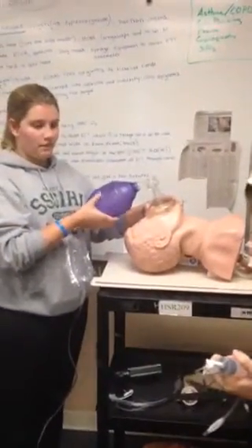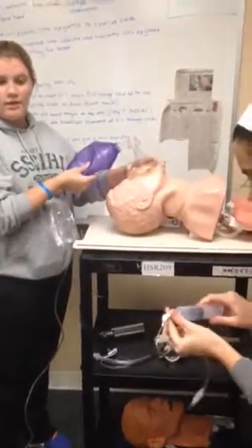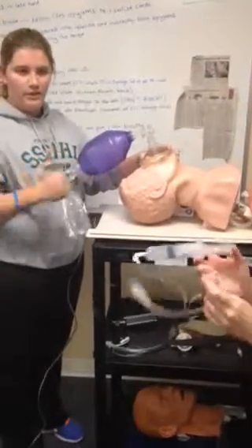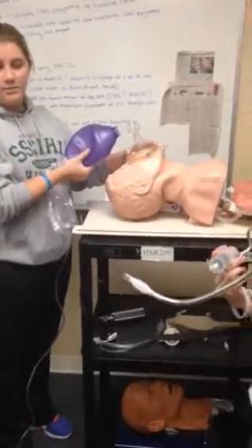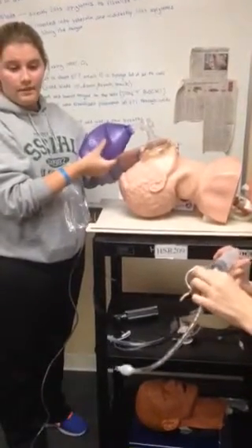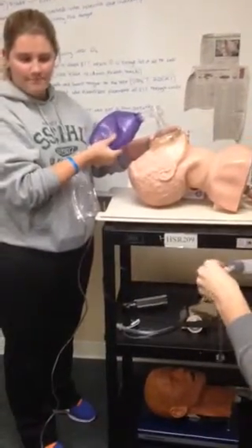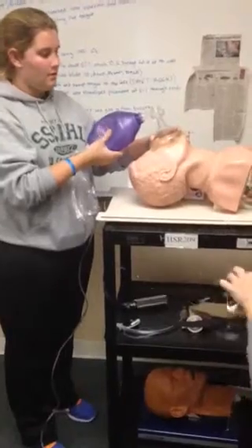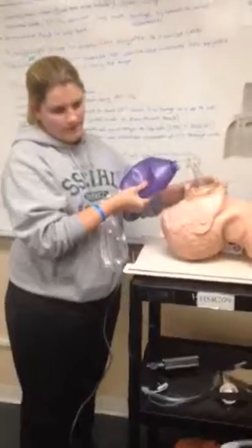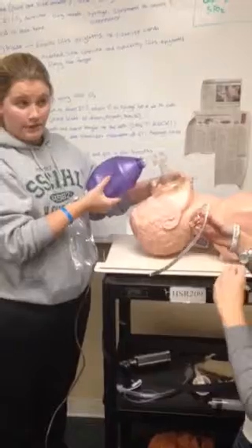The assistant is going to inject air into the cuff to make sure it is working and there is no leak. She has placed the stylet into the ET tube to help shape it in order to help it enter the trachea. It appears the cuff is working. After she's done all that, she will hand me the laryngoscope.